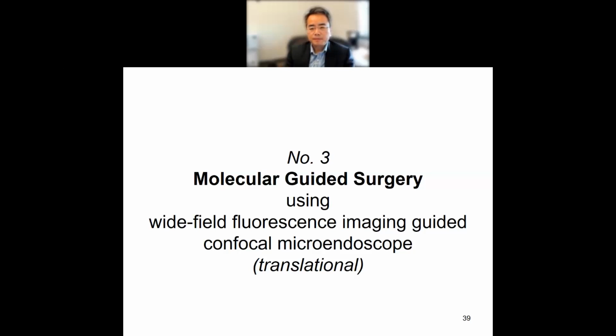That's why the imaging frame rate has to be high. What we found in the clinics is that more than 5 frames per second is sufficient for surgeons. But definitely you'd like to produce video rate. 30 is our goal, but most of the time we just stay with 5 hertz, which is sufficient.